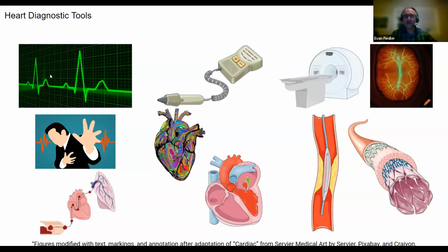When we look at an EKG, we can use it to find myocardial infarction. Myocardial infarction will be indicative in the EKG. Also, pulmonary embolism, interestingly enough.